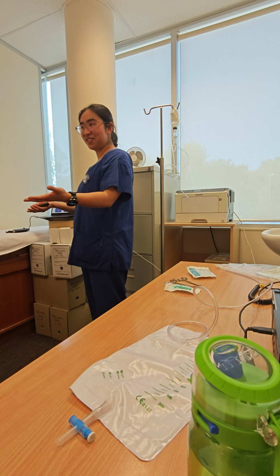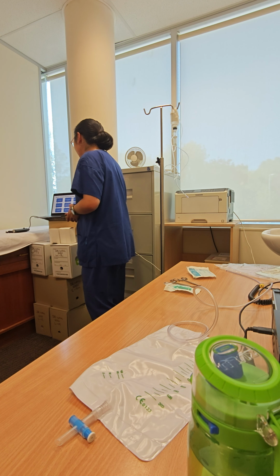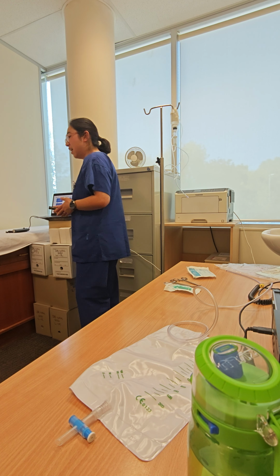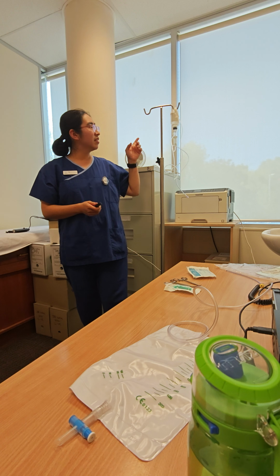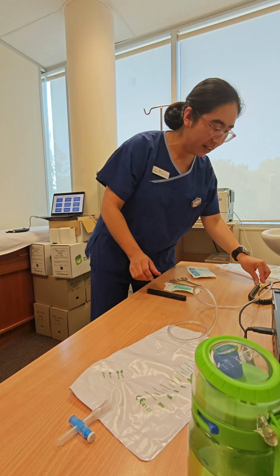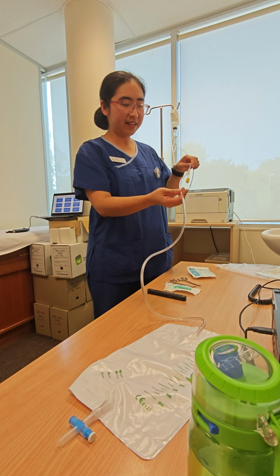If we got yes, we're gonna start the cystogram. And then we're gonna lie him on the table, supinely. And now we're gonna connect our contrast into his catheter. All right. Now this is the patient catheter and catheter bag.